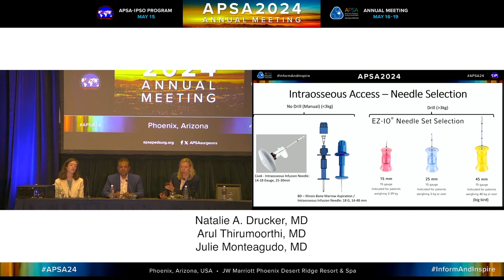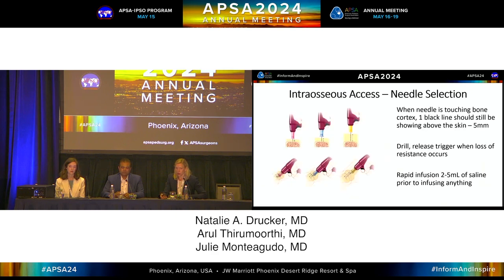And there's actually videos on the Google Drive. I didn't want to get too into IO because everyone kind of knows the principles, but we have the videos on the Google Drive for your review. In terms of choosing the length, the most important thing is that you want to make sure it's long enough to get through the cortex and into the marrow. Once you put the needle in and it touches the bone, you want to make sure you have at least 5 millimeters still showing on top of the skin.